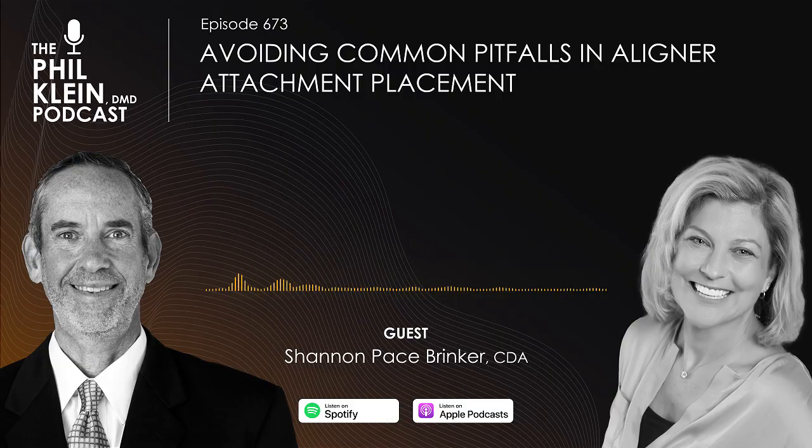So let's get back to filling the template. Absolutely. So the one thing that I see a lot in practices is, again, they're utilizing a flowable. They're using a runny material. And the other thing is that you think about having three attachments, you need something strong. What I tell offices is, again, I'm very black and white.